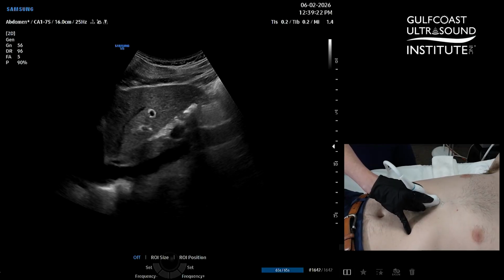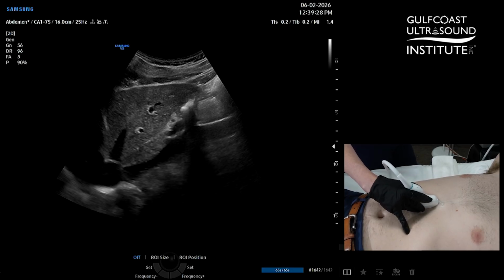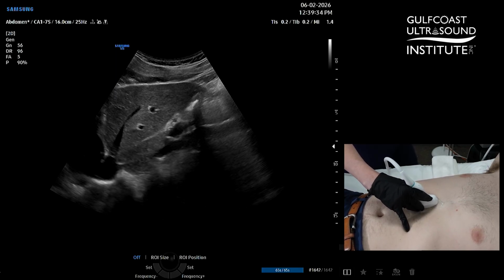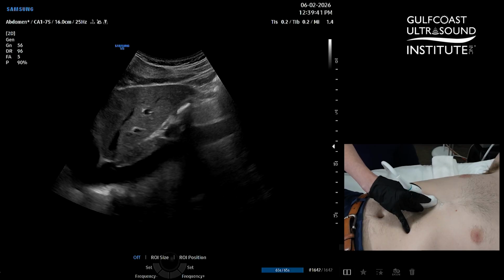An alternative view for finding the inferior vena cava. Do you ever struggle to get this perfect view of the inferior vena cava? Well, we're going to show you an alternative way to visualize the inferior vena cava in case you don't have the perfect view on your ultrasound screen. Perhaps the patient is too gassy, or their body habitus won't allow you to visualize that IVC.